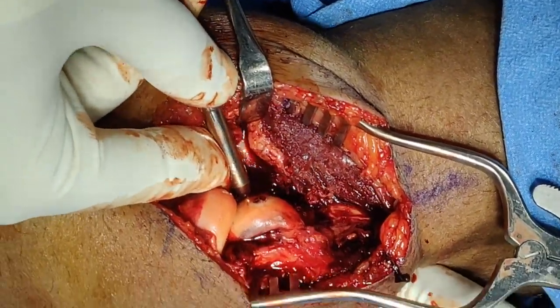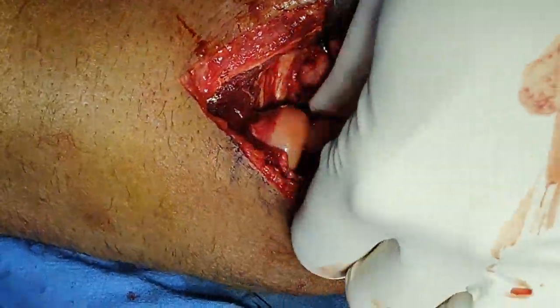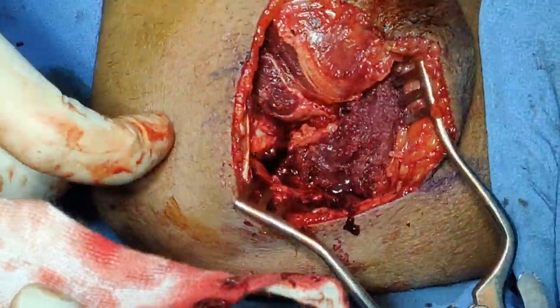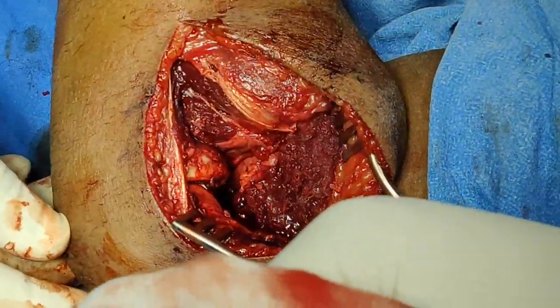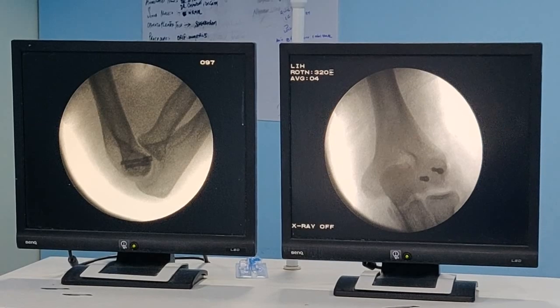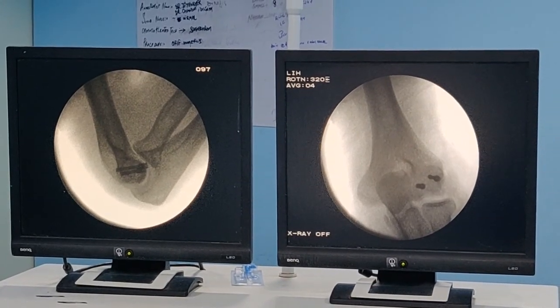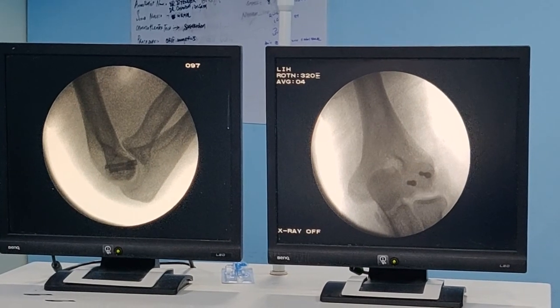The screw looks well seated. Taking the wire off — it is nice and solid. There is no reason we can't start mobilizing straight away. We have checked the position of our screws on both AP and lateral views and it looks anatomical. Excellent result. Now it is just a matter of closure.